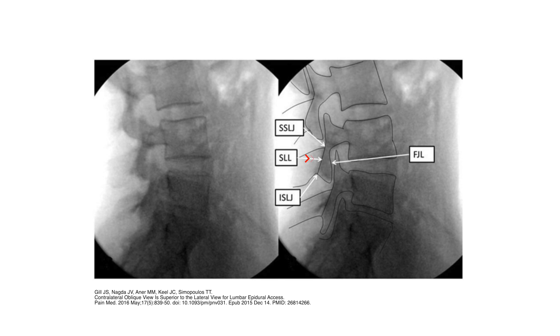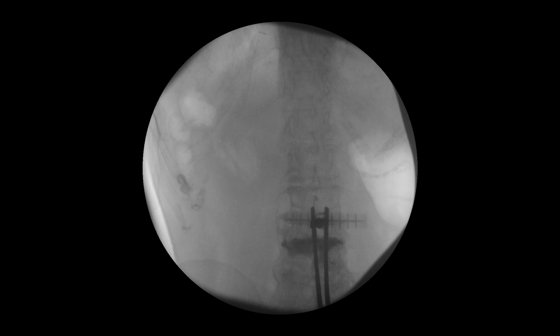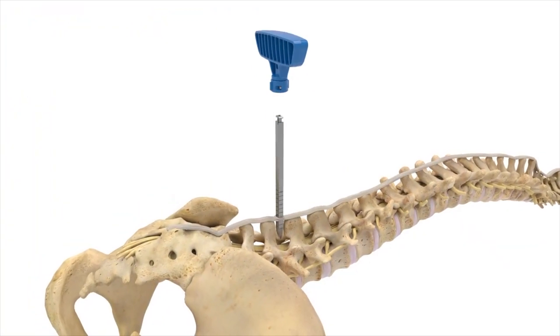On the lateral view, the spinal laminar line connects the superior spinal laminar junction to the inferior spinal laminar junction. Each junction represents the intersection of the lamina with a spinous process. After midline position is again verified in the AP view, the dilator assembly handle is removed, leaving only the dilator.